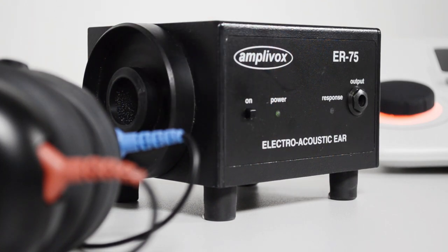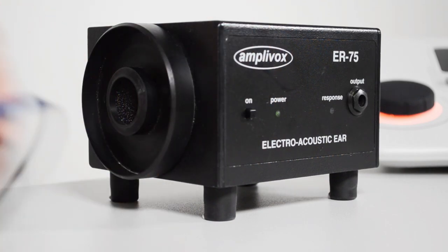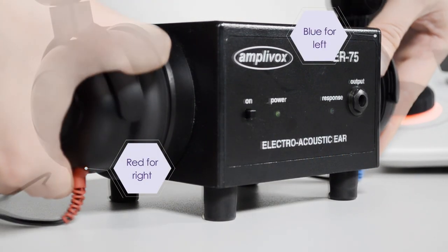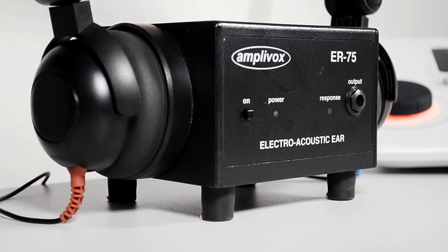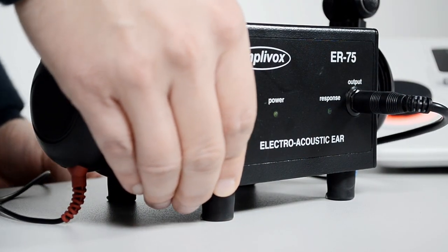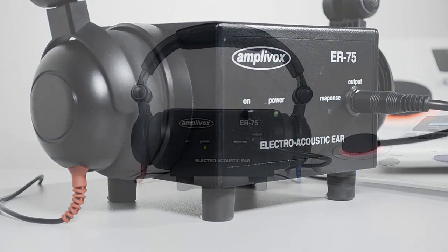Step 1: Turn on the ER75. Step 2: Place the headphones of your audiometer onto the earphone couplers of the ER75. Step 3: Use the interconnecting lead to connect the output socket of the ER75 to the patient response socket of your audiometer.